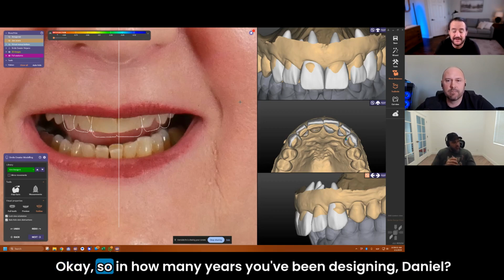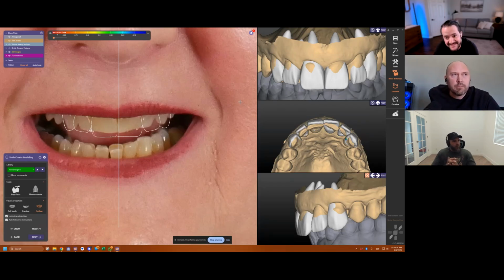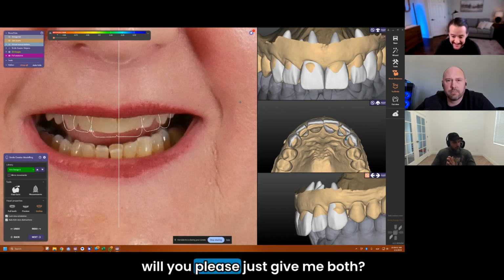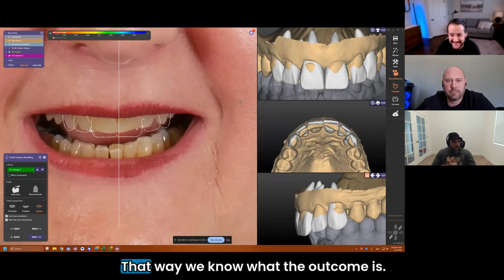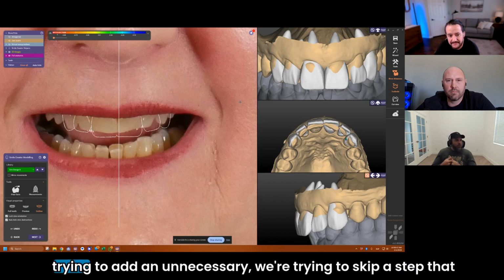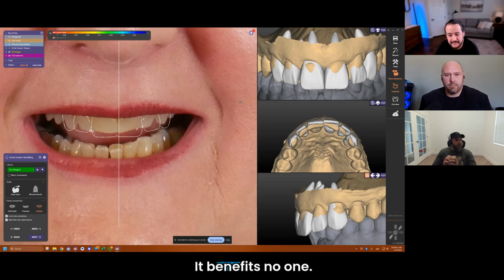Okay. And how many years have you been designing, Daniel? So after 14 years of designing, what you've concluded is, doctor, will you please just give me both? Yeah, that way we know what the outcome is. I think, with all due respect, we're trying to add an unnecessary step, or rather skip a step that doesn't need to be skipped. It benefits no one.